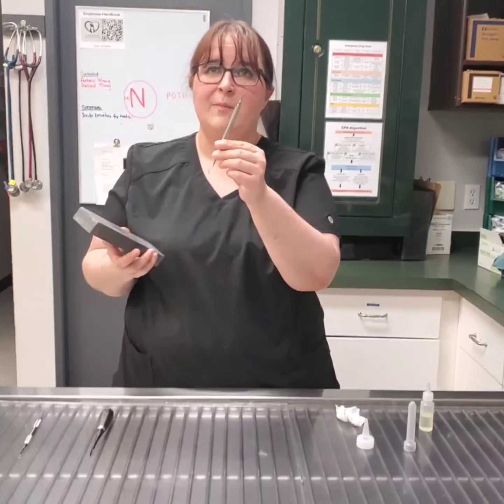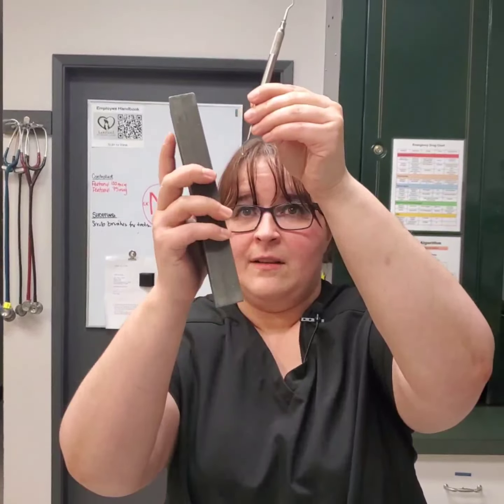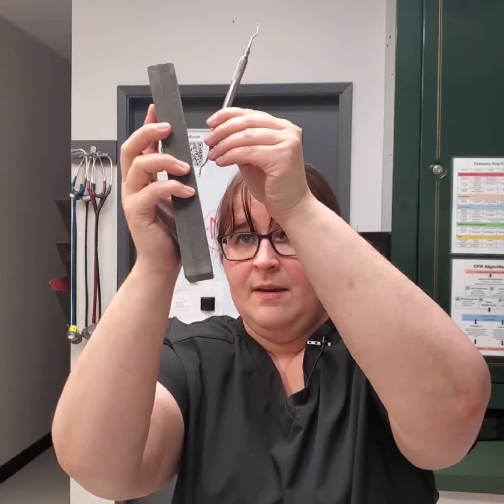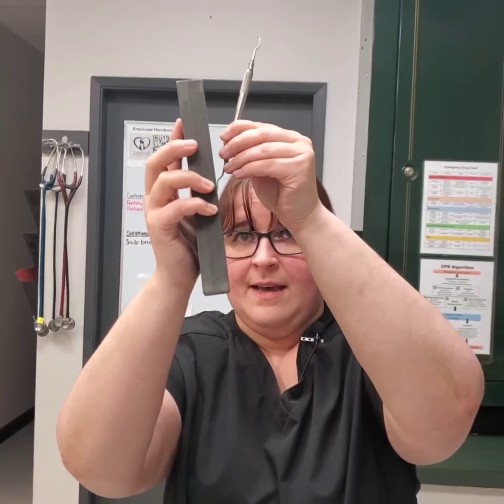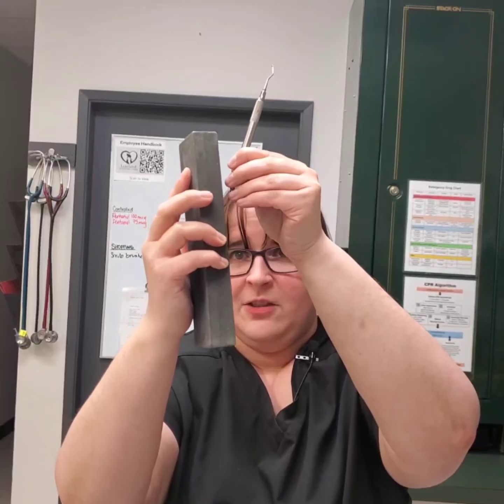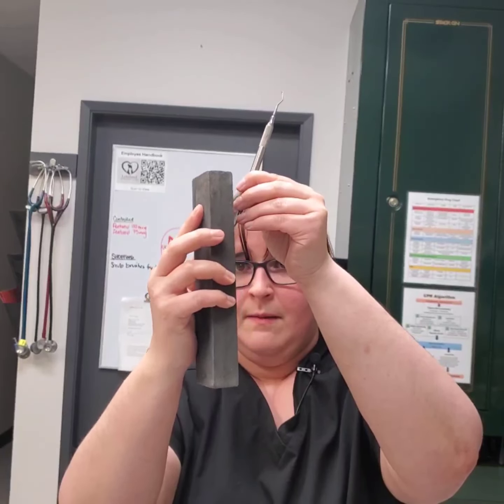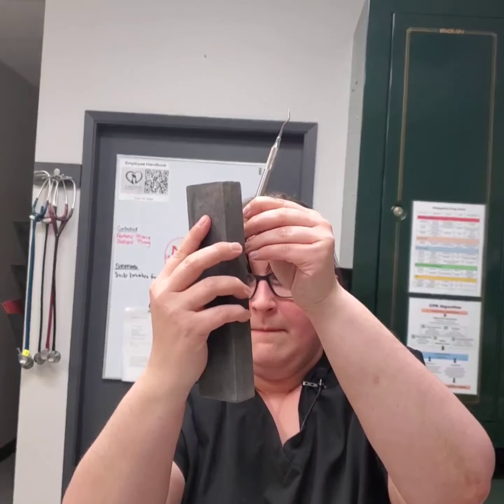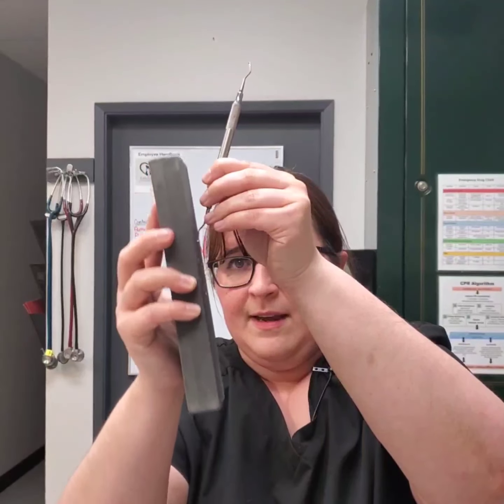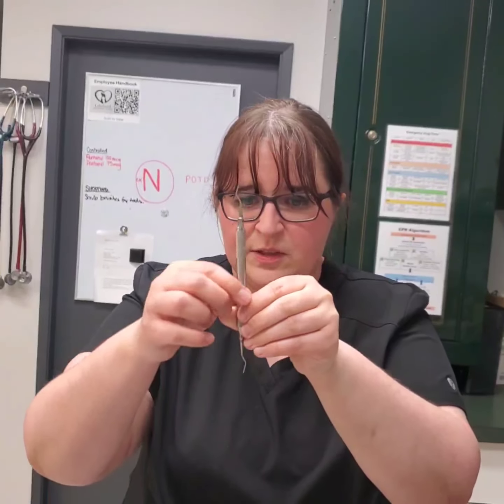And the curettes operate in a similar way in that I'm going to have the distal shank here vertically. I'm going to line it up with the clock, and I'm going to line the stone up with 1 o'clock, and I am going to sharpen that edge here. And with the curettes, I really want to make sure that I go to the front and get that rounded toe. And I'm going to go back, and I'm making sure that I'm lined up with the 1 o'clock and end on the downstroke. And now I'm going to turn the curette so that it's facing me, and I'm going to switch hands.